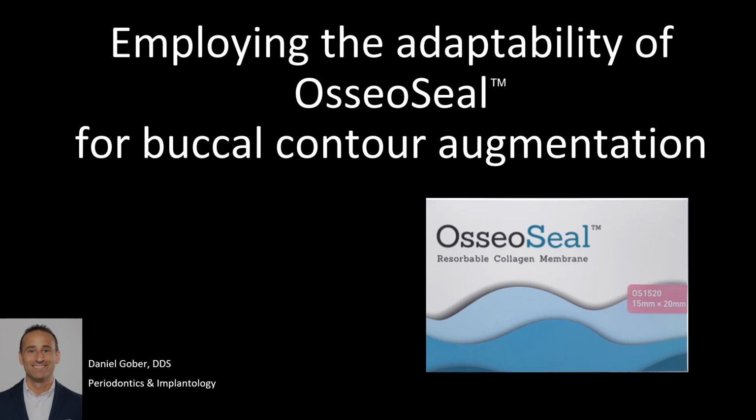Welcome everyone, my name is Daniel Gober, and today I want to share a short case that's going to illustrate why I love to use Osseoseal as my membrane of choice when it comes to buccal contour augmentation. Osseoseal is a resorbable collagen membrane, has a lot of great features to it, great handling characteristics, but in particular I want to illustrate its ability to adapt to the area that you're trying to regenerate, which is specifically relevant when you're trying to accomplish buccal contour augmentation.